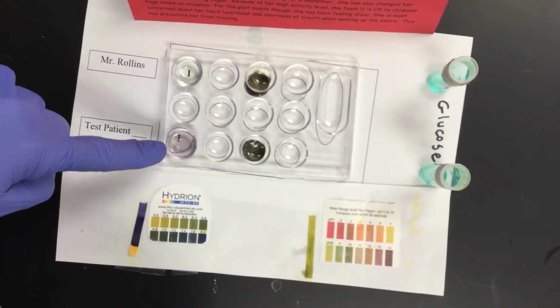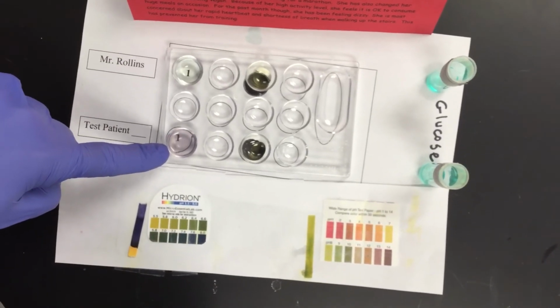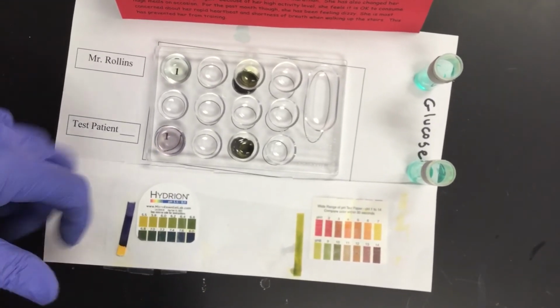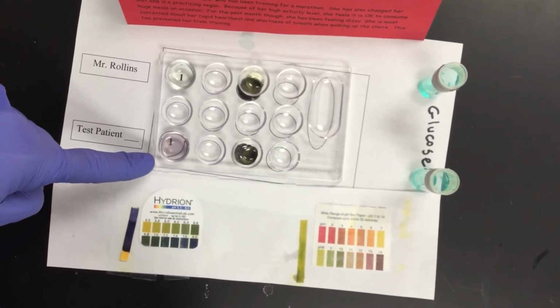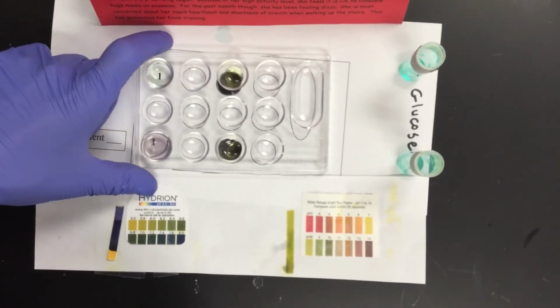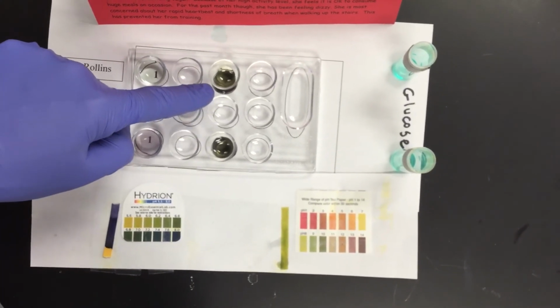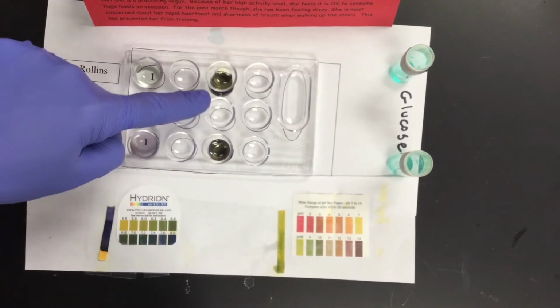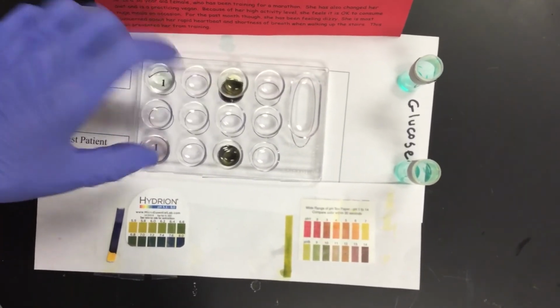However, test patient number 18, same thing, urine, biuret solution. After about 3 to 5 minutes, we now have this purplish pink color there. So that would be for your proteins. Chlorides, I put it onto a black background for you. If it was positive for chlorides, that sample should turn a cloudy white color, which means that there would be a precipitate in there, which would be the chlorides.